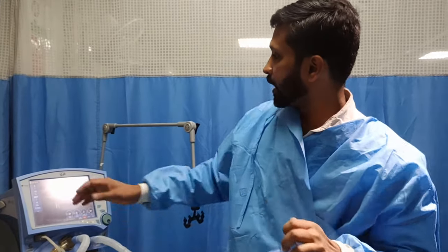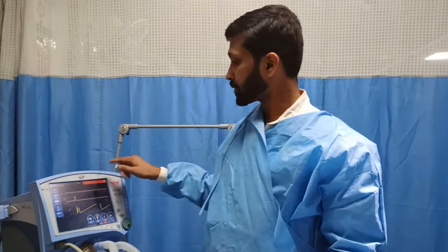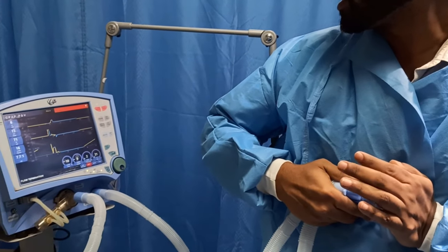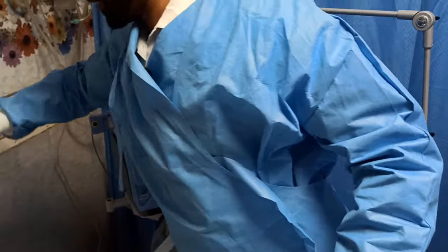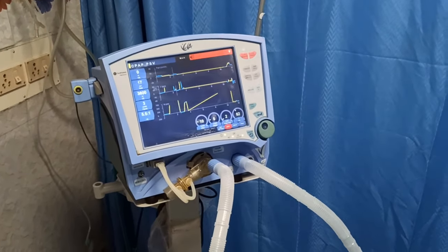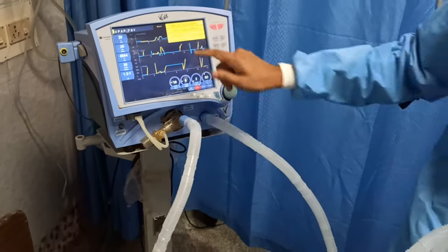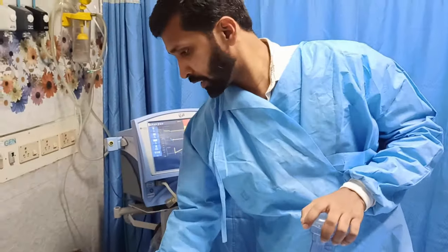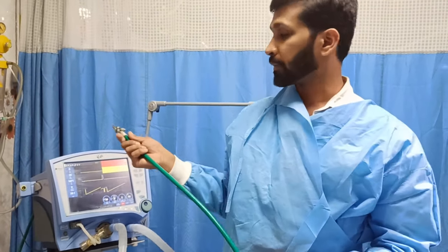Okay, and other alarms that usually come in the ventilator when you are using a CPAP mode of ventilation is this circuit disconnection, because it is open. If I close it like that, that will be gone. Now it's low VE because I am not breathing, there is no expiratory volume, that is why low VE is coming. Another one is, if I remove the oxygen and give this one, it will show low oxygen inlet. Low oxygen inlet will come if the oxygen port is not properly connected. If you didn't connect this port properly to the wall mount oxygen, it will show low oxygen inlet.